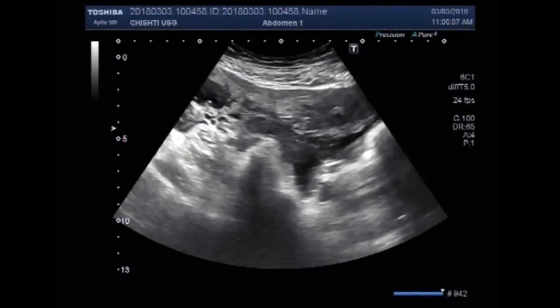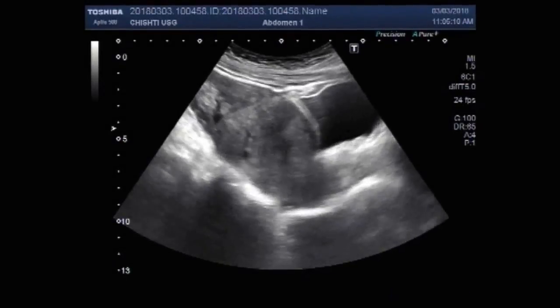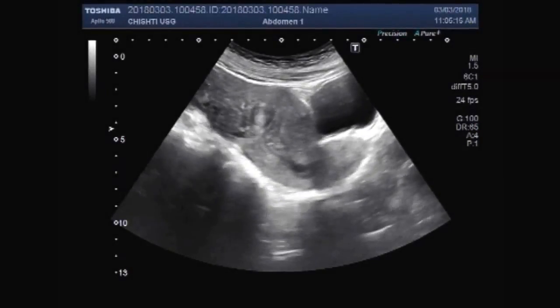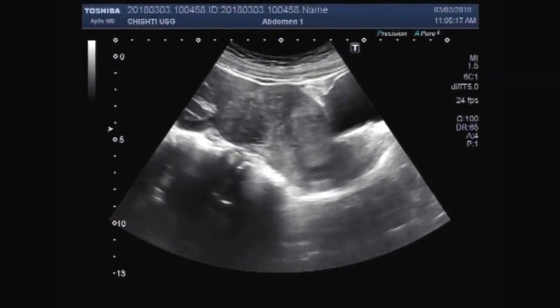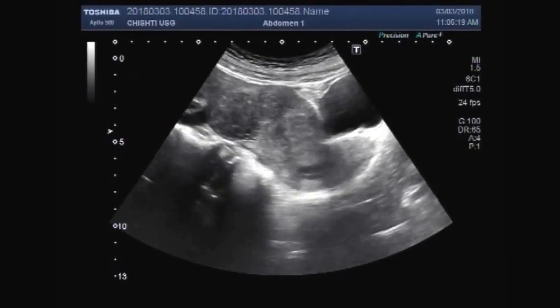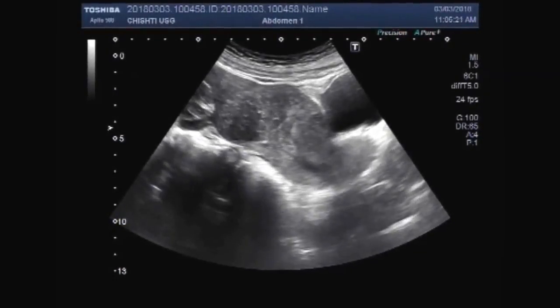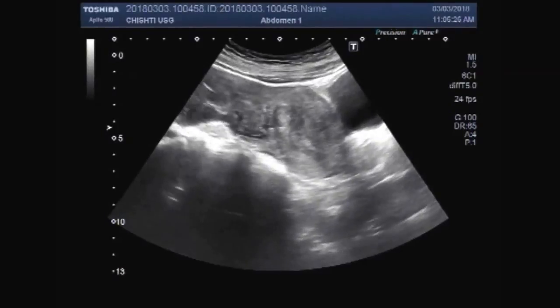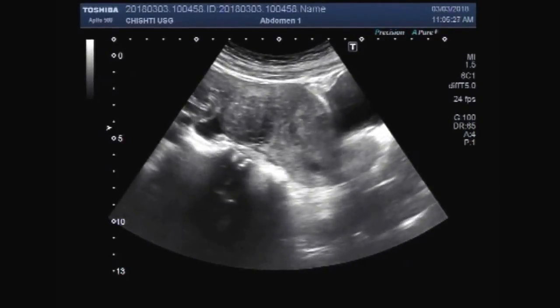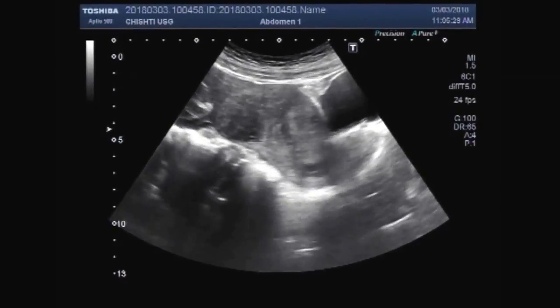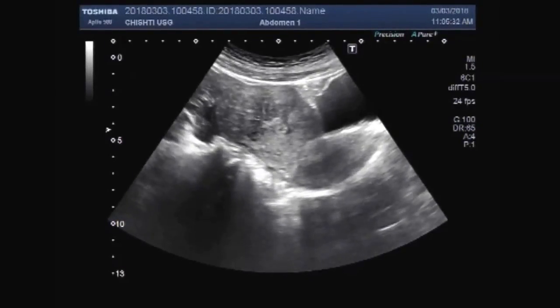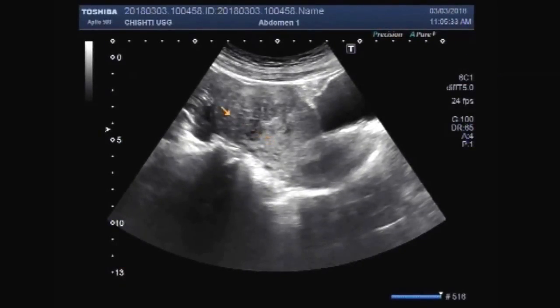Dear viewers, I hope you are all fine. This ultrasound video shows two uterine masses and twin ectopic pregnancies — left ovarian pregnancy. One fetus is alive and the other is dead with a ruptured gestational sac.